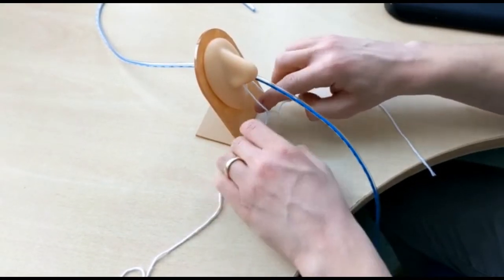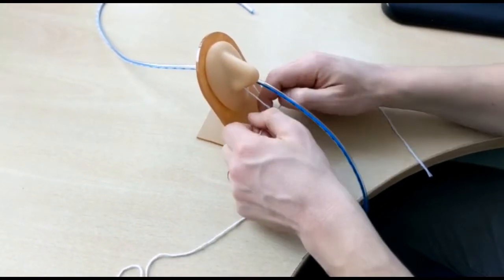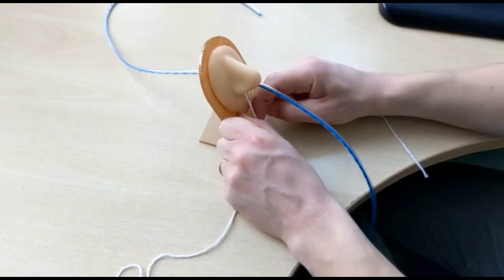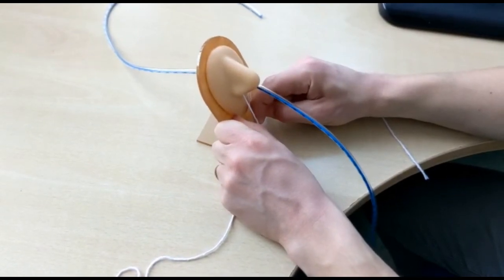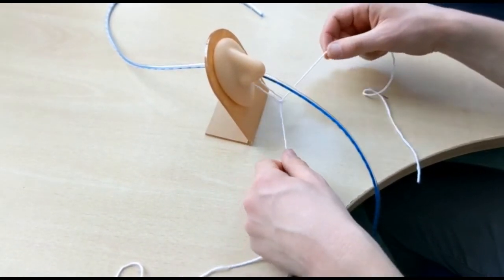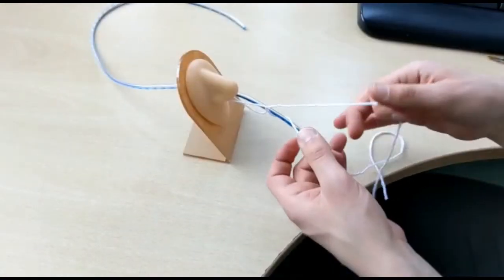Tying technique can be practiced using standard string and a model nose. The initial knot should have a good amount of slack. It is essential for there to be at least 1cm between the first knot and the philtrum to prevent pressure sores.